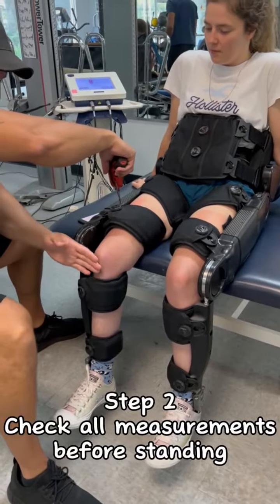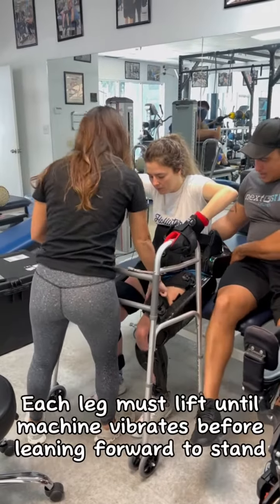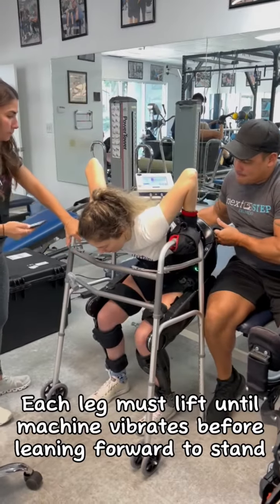Step 2: check all measurements before standing. Each leg must lift until the machine vibrates before leaning forward to stand.